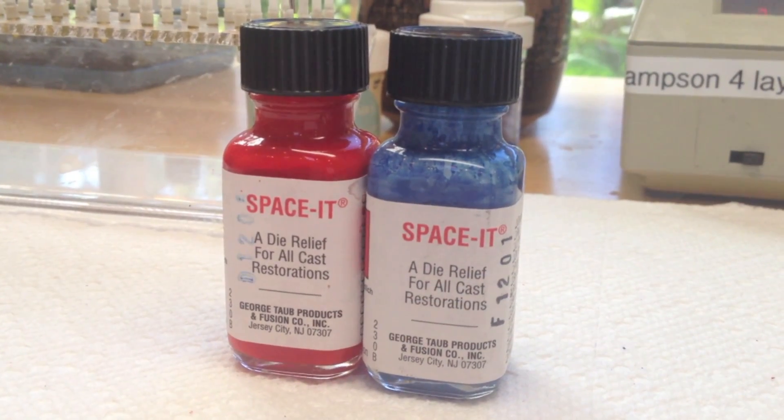After my undercut wax is applied, I use two coats of die spacer. I use a Space-It product from Taub. I found that it works fine. There are a lot of other products out there, but that's what I use, and after I have applied that, I am ready to start waxing up.